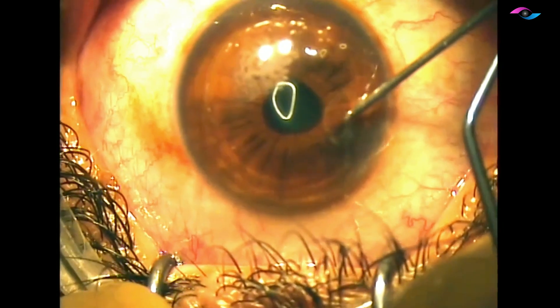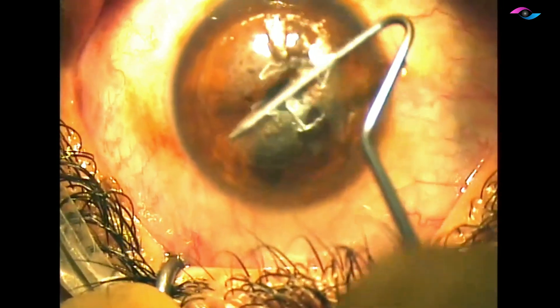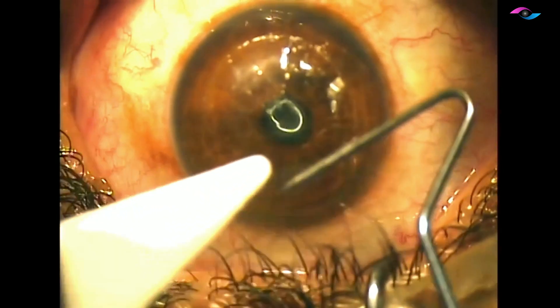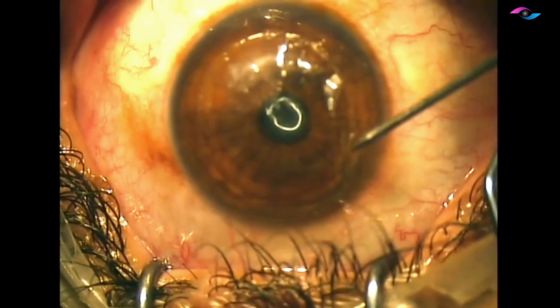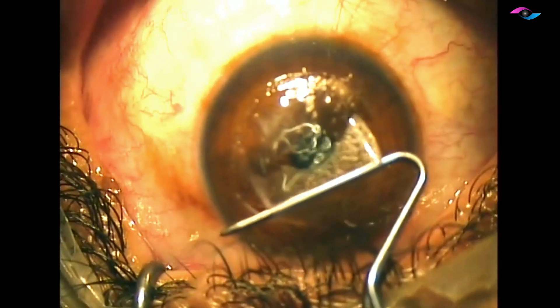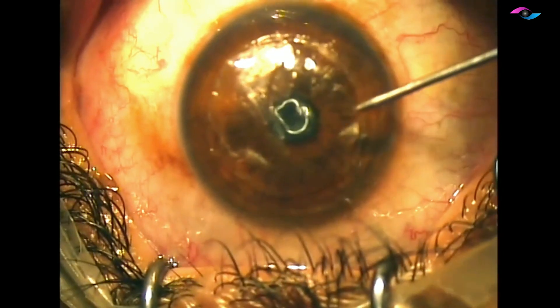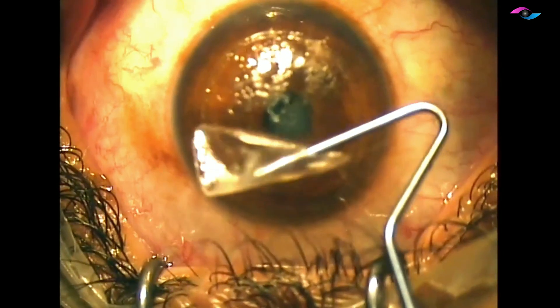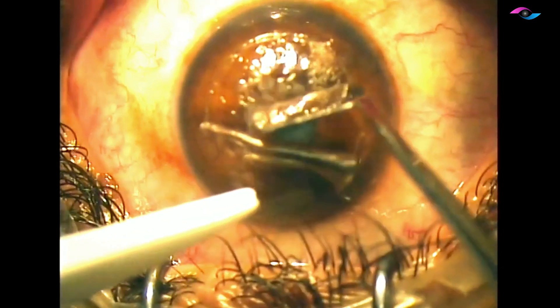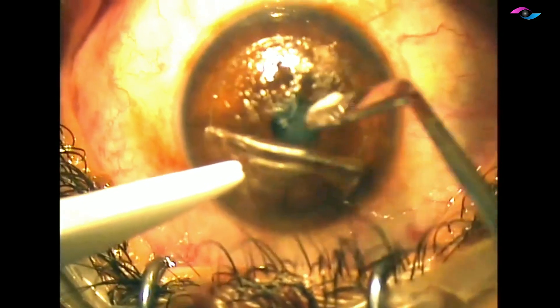I'm cleaning up here because I don't want these epithelial cells to get seeded into elsewhere on this LASIK flap. Once we have done that, we are lifting it up and reflecting the flap back, then using a hockey stick instrument to debride all of these epithelial cells.